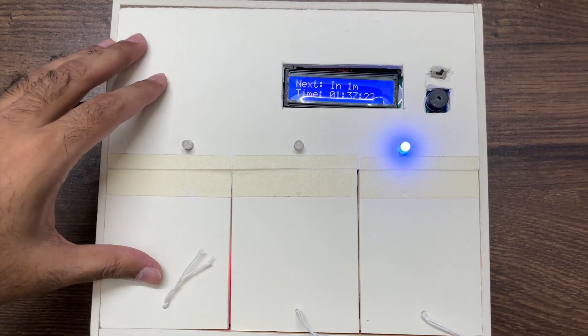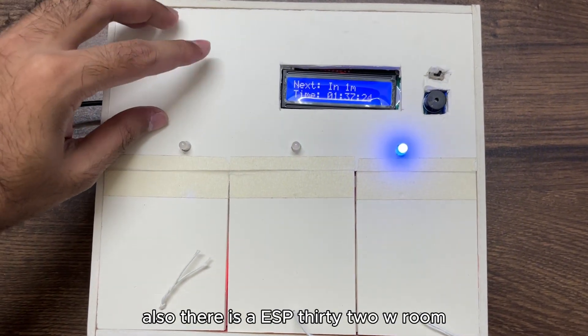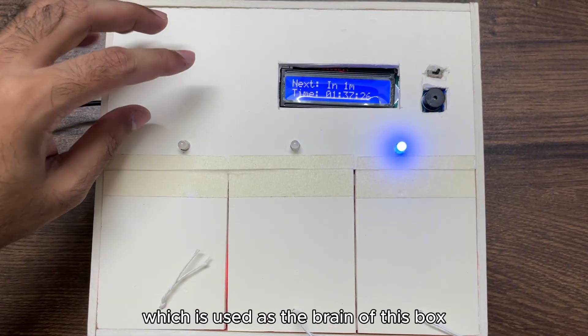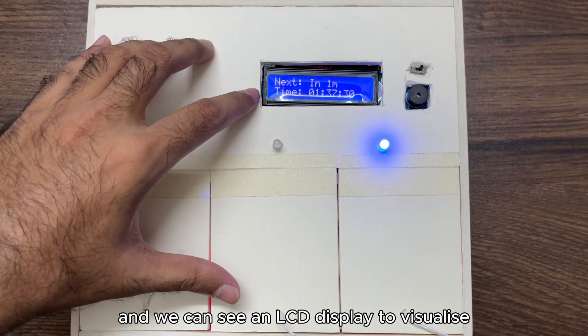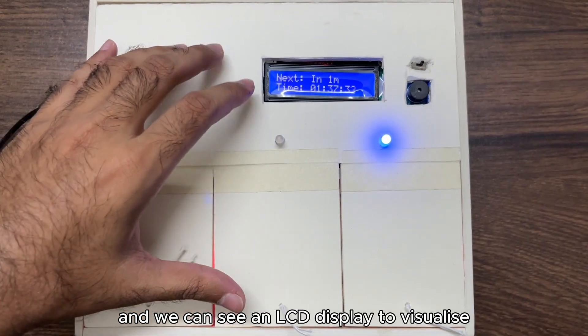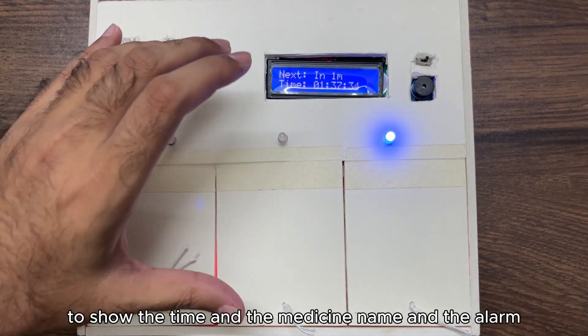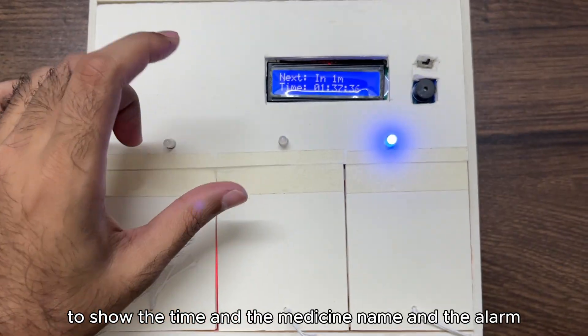There is ESP32 dual core which is used as the brain of this box. We can see an LCD display to visualize, to show the time and the medicine name and the next alarm time.